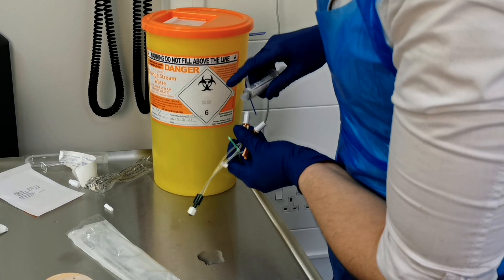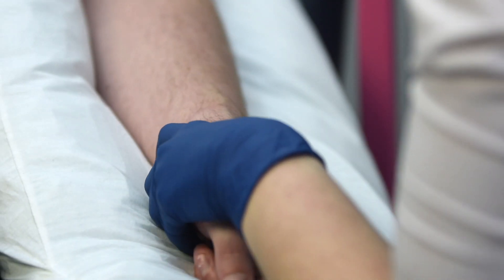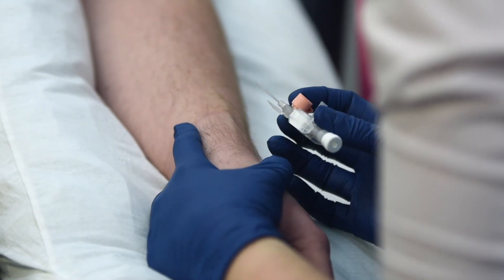If you're going to use an octopus or giving set, now is the time to flush the octopus so that it's ready to be attached to the cannula once it's inserted. Hold the patient's hand or arm and put skin traction onto the hand or arm so that the vein is not going to move.